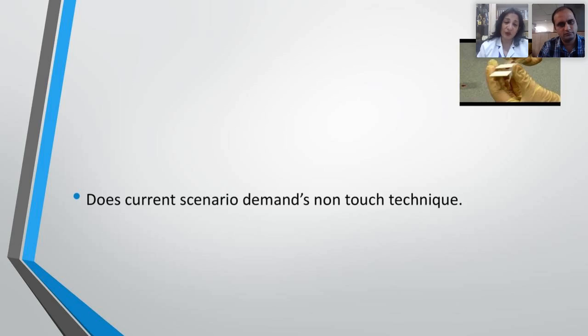There are problems with the physical review of the slide, which include slide storage. There is limited specialist opinion which can be taken when a slide is being seen by you. You cannot take a peer group analysis or their review incorporated in the diagnosis. It's labor intensive.